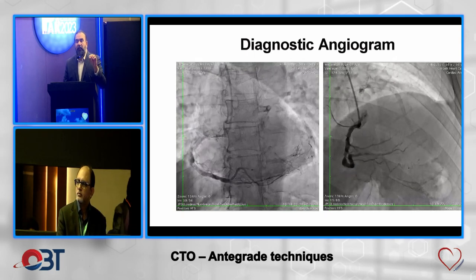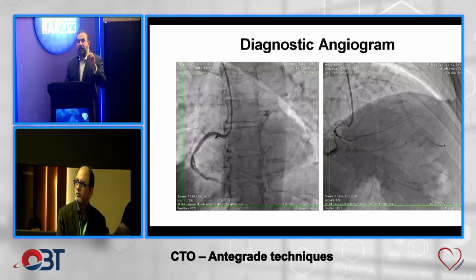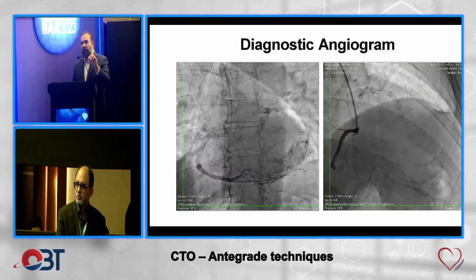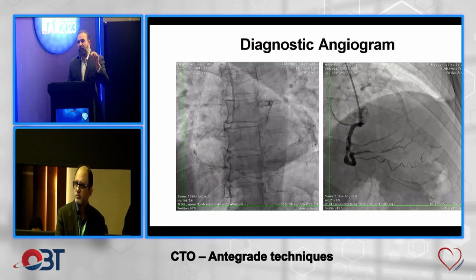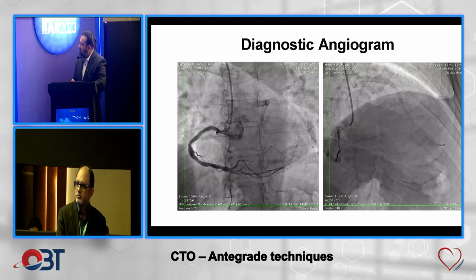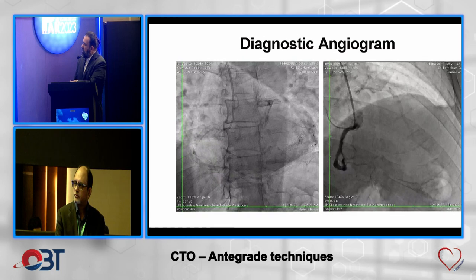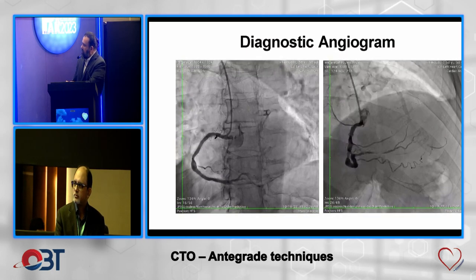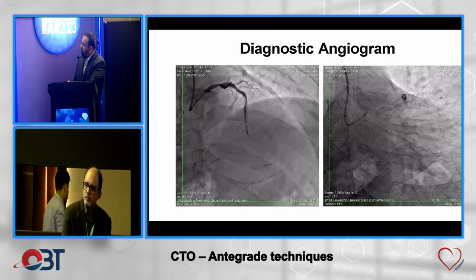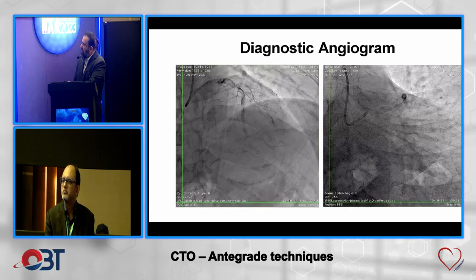Now, if you have a donor artery that's relatively okay, and you see a CTO, then maybe it's a subtotal or more recent occlusion. Like in a true CTO, that shouldn't give you angina unless you've been having angina for many, many years. Now this person obviously was having angina for many years, but it changed from stable to unstable over a few weeks ago, and probably it's the progression of disease in the PDA. But when you look at the LAD, you can see, again, the LAD is cut off in that apical segment.